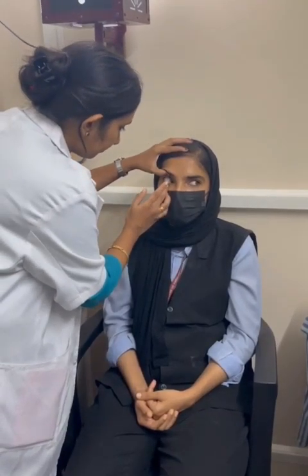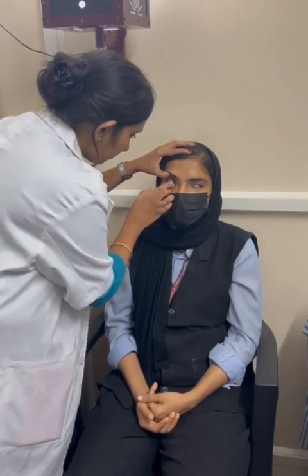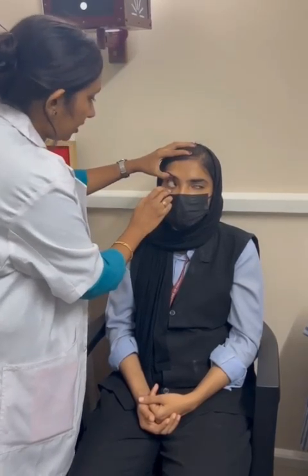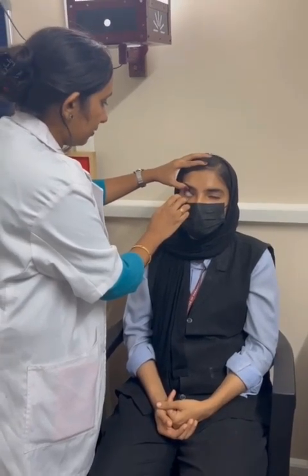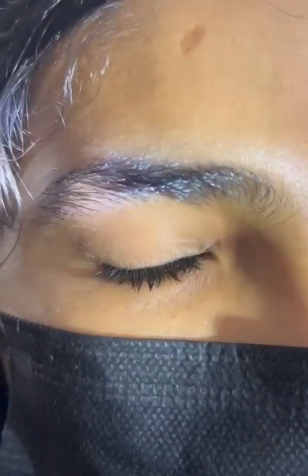For insertion, hold the upper lid along with the lashes and pull down the lower lid with your middle finger. Place the lens with your index finger. Then gently release the lower lid first, followed by the upper lid. Now look for lens fit — check for centration, coverage, and movement.